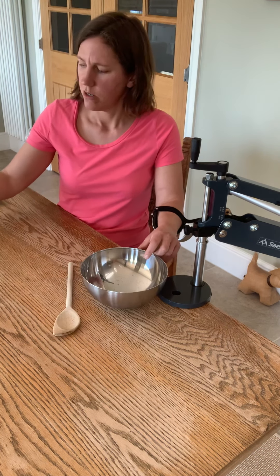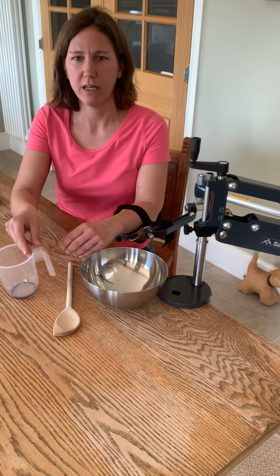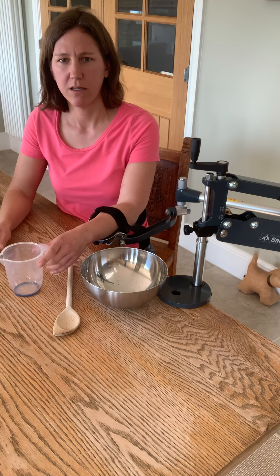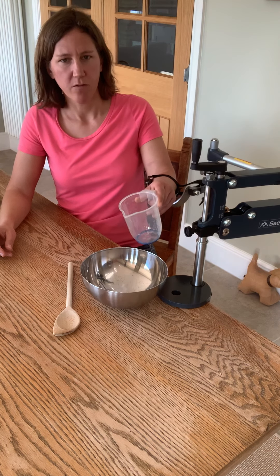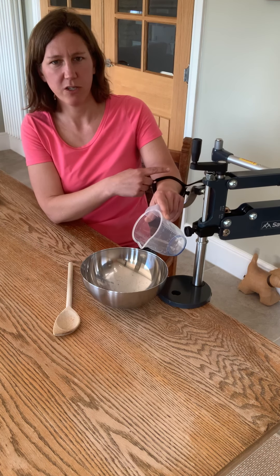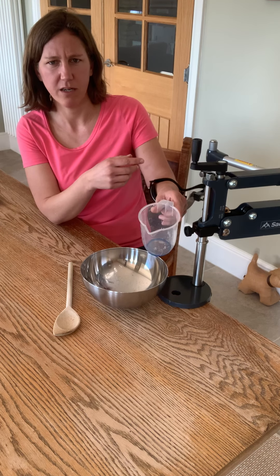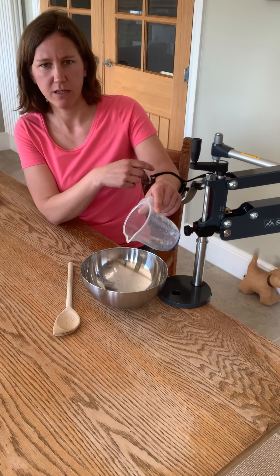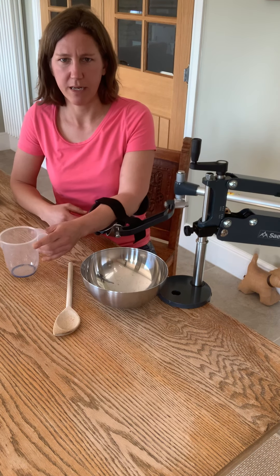For everyday tasks, there's no reason you couldn't start home baking. I'm in the kitchen, so I've got a jug here — which is great practice, a nice large object to work on, trying to get my hand around it and then practicing the movement of tipping. This is where that additional attachment comes in, because I'm turning my palm down and practicing pouring into my mixing bowl, and then I can practice placing that back down again.